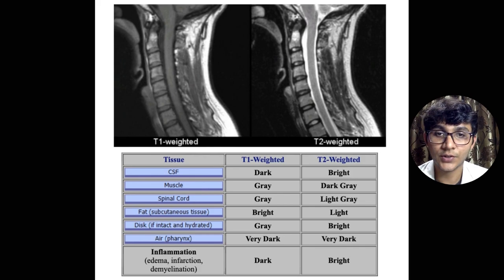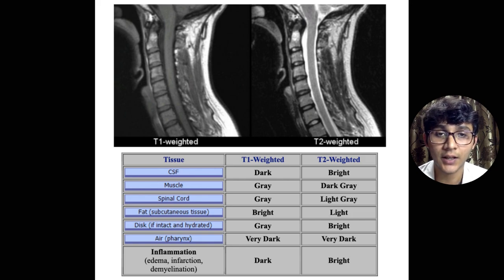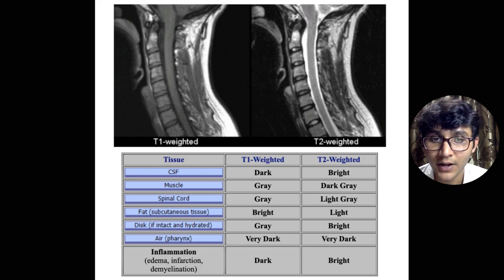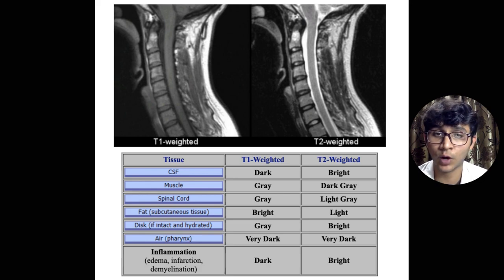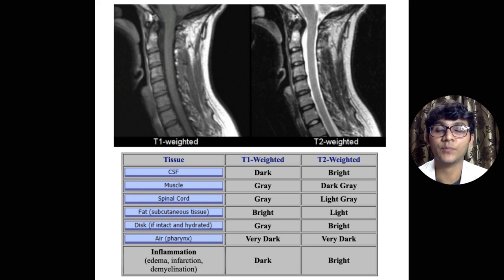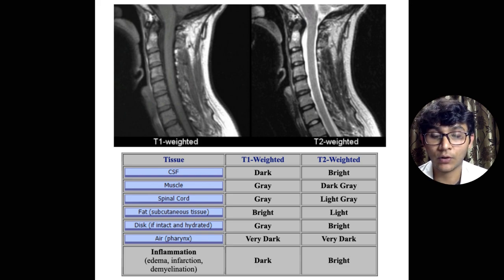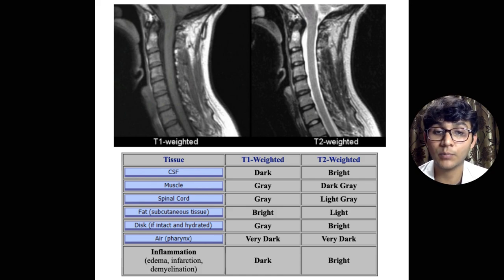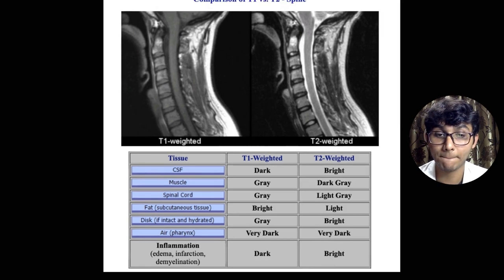Here is the sagittal section of the spine. On the T2 weighted image, you can appreciate bright white CSF right around the spinal cord. Also notice that the intervertebral discs between the vertebral bodies appear slightly brighter on T2 than T1, due to the nucleus pulposus — a watery, protein-rich substance inside the disc. Similarly, inflammatory substances, edema, infarction-related problems, and demyelination will appear very bright on T2 weighted images.